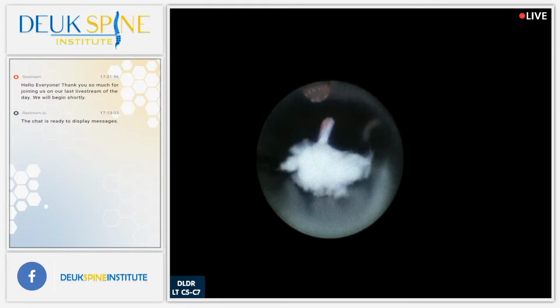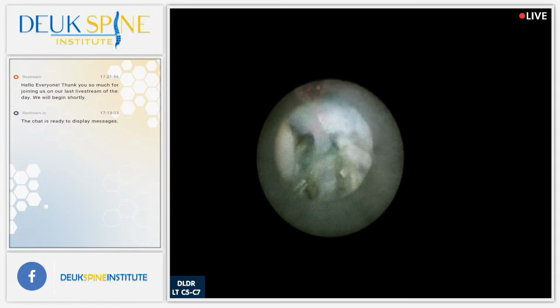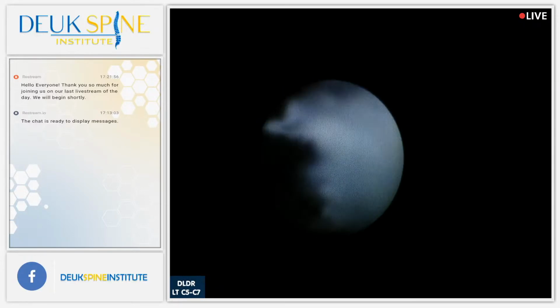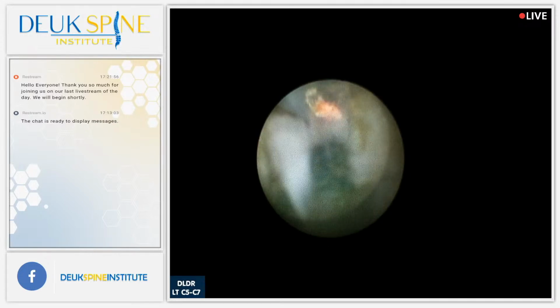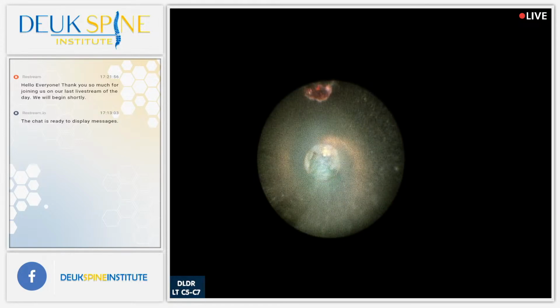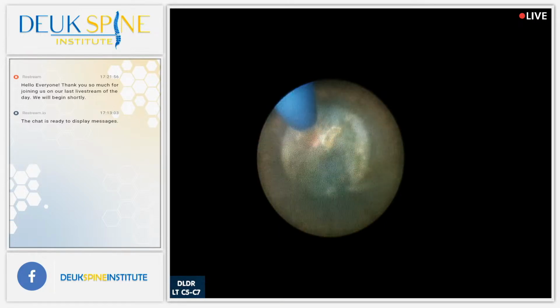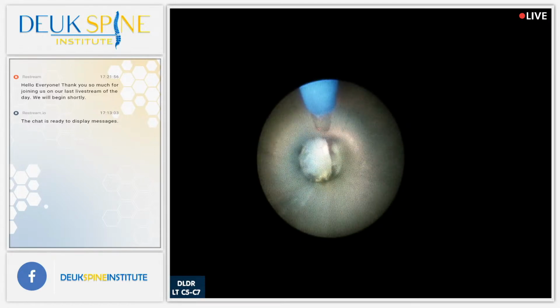More pieces of herniation. It's another piece of herniation. Grab her.